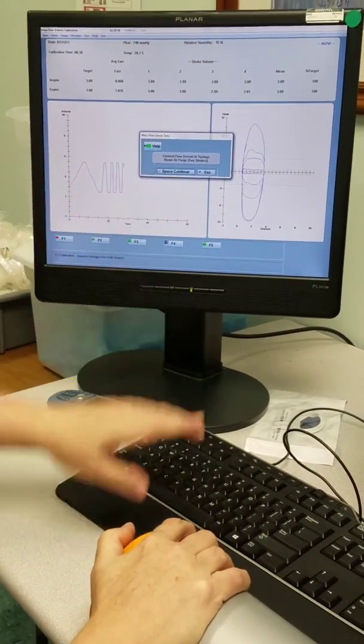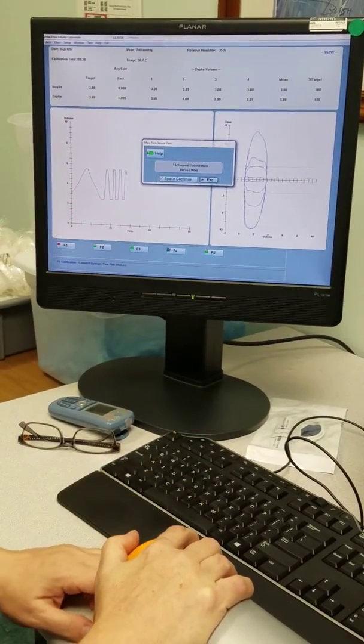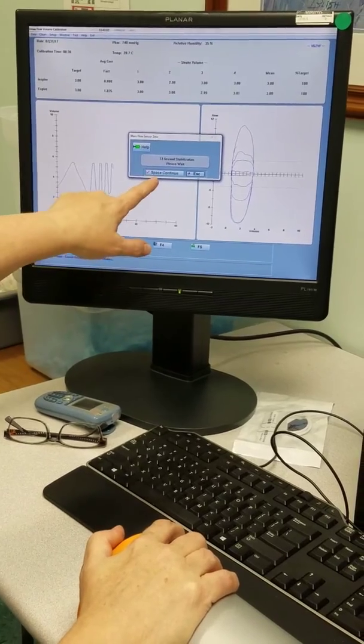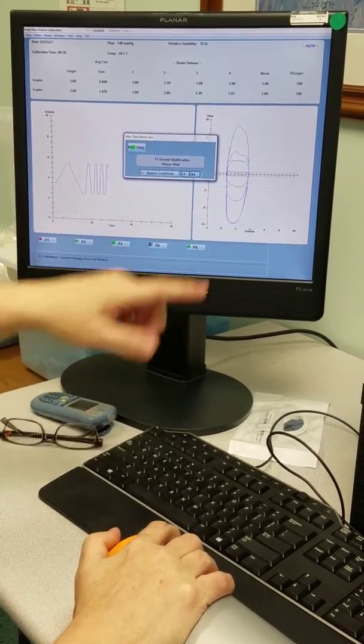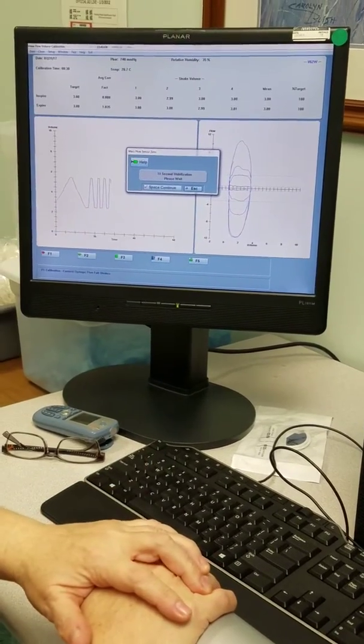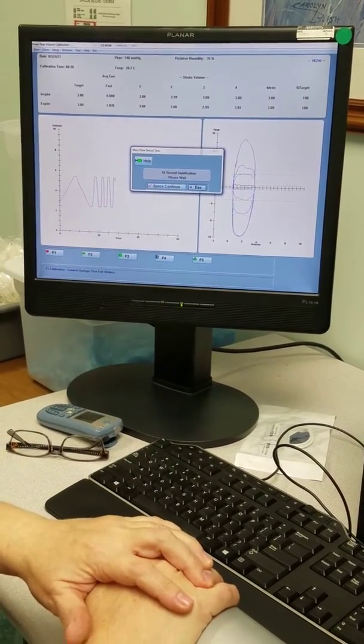Then you just hit spacebar to continue. Now the machine is zeroing it out. All you can do is wait.